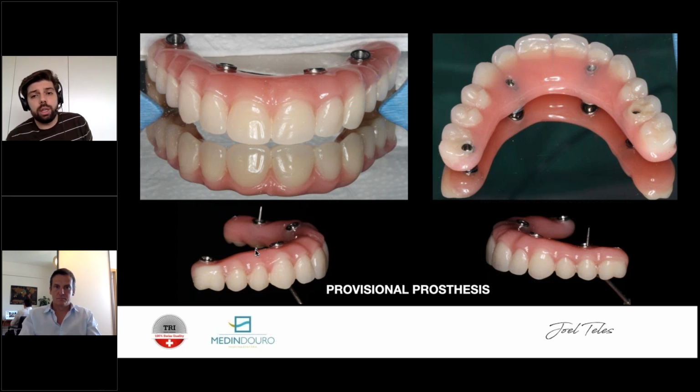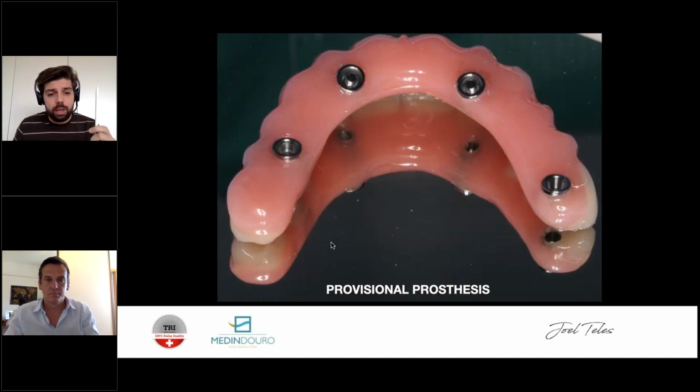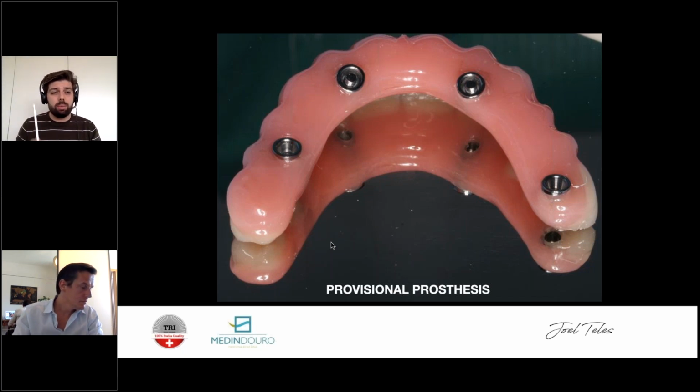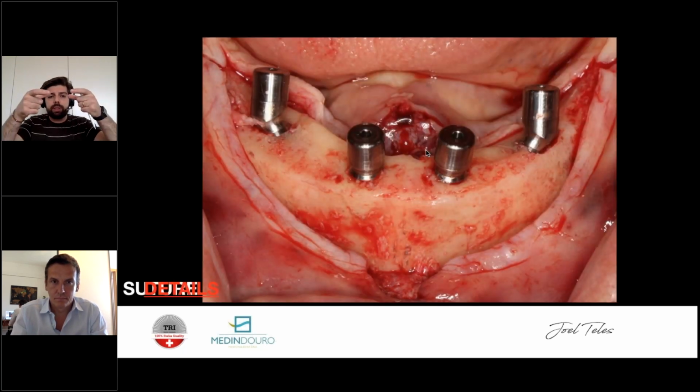If not, you'll be damaging your healing. And see about the prosthetic space that we've discussed. If you're not creating a shelf here, normally you will not get this high, and therefore you will have problems. Some people ask me, don't you have breaking on your provisionals? Nowadays, a very, very small amount of times. And why? Due to thinking about the space you need. If it's restorations like this, think about 15 millimeters. Sometimes the patient is very big, very strong, even higher, 18 millimeters. Keep this all in mind. Otherwise, they will be too fragile, and of course, they will break. See the bottom of the restoration, very cleanable, no concavities whatsoever, and no pieces of metal exposed. This is very important for the tissue to have space to lie.